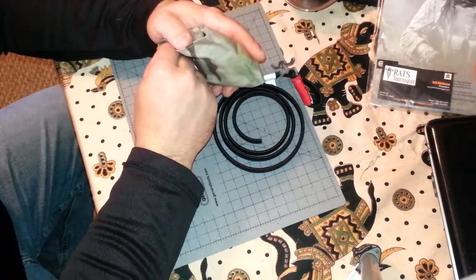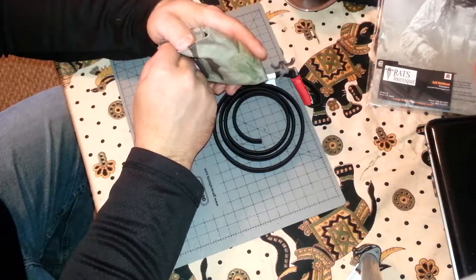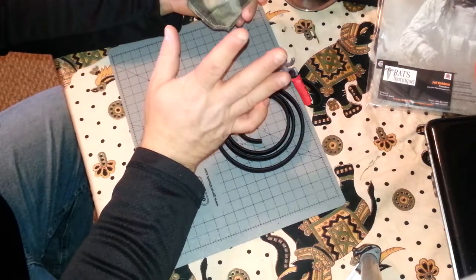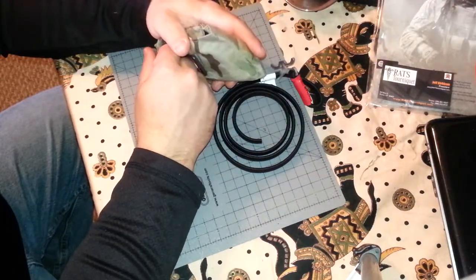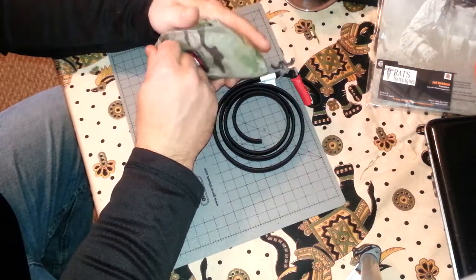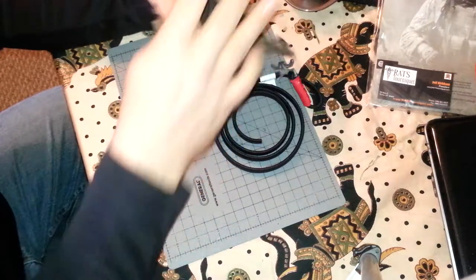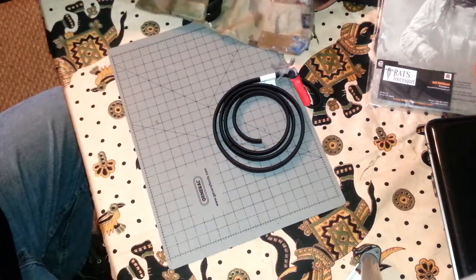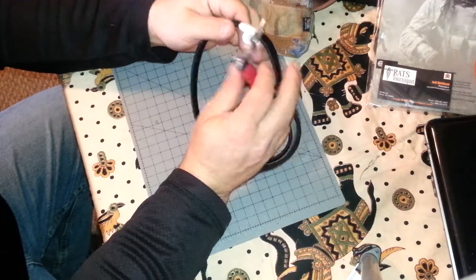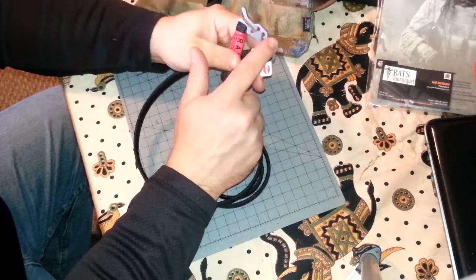Those precious couple of seconds you're trying to get that windlass tightened down — honestly, that can determine whether that person dies. Could be you, could be your child, could be a stranger on the street who just got in an accident — a motorcyclist who just had his leg ripped off. You may very well save that person's life. As Skinny Medic says, you never know when you're going to be the first responder.